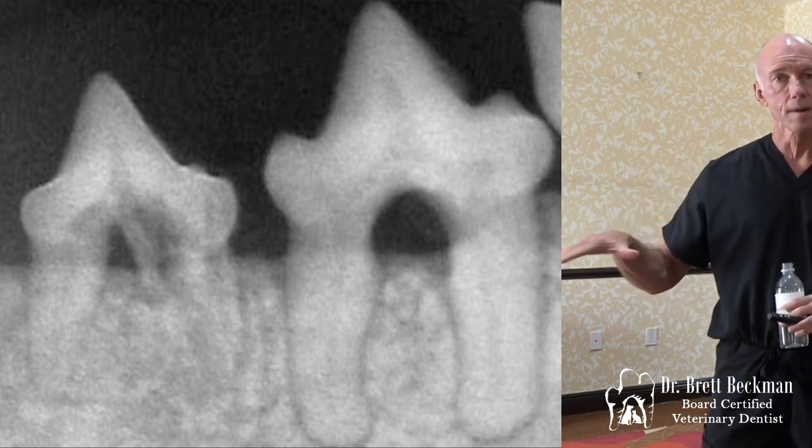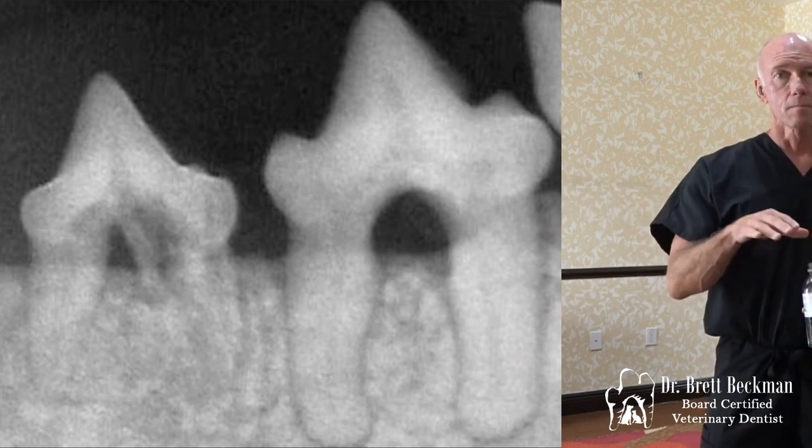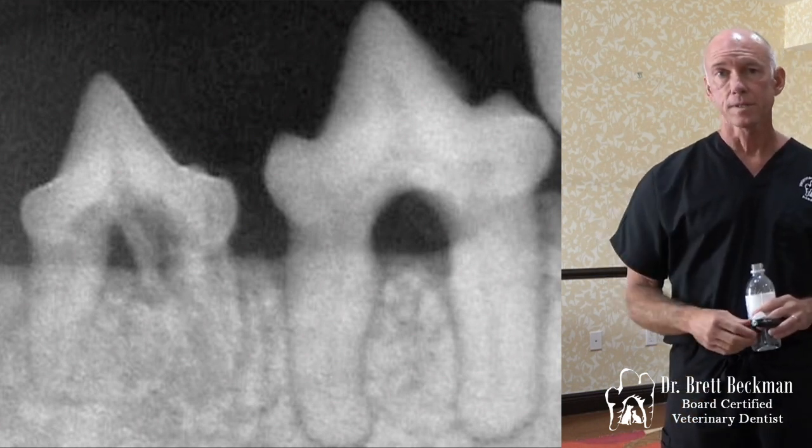Go in there, use your diamond football burr, go to where you see it radiographically, confirm it visually, and then you're ready to close it.